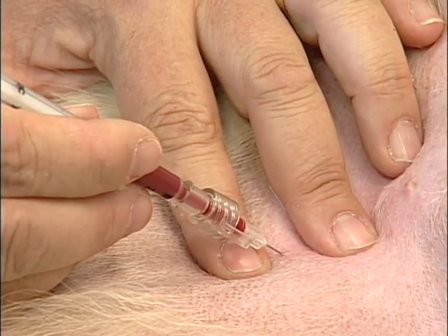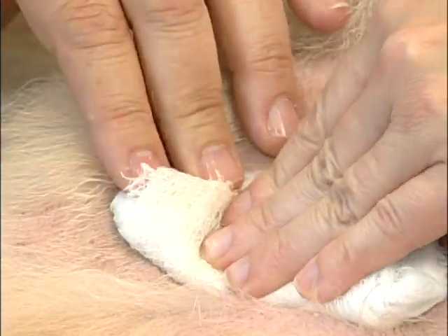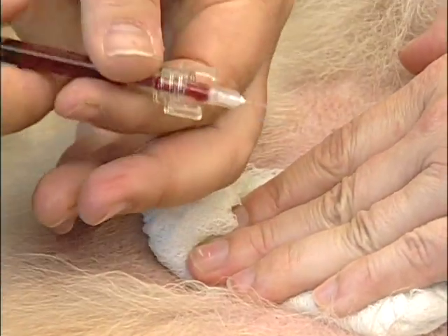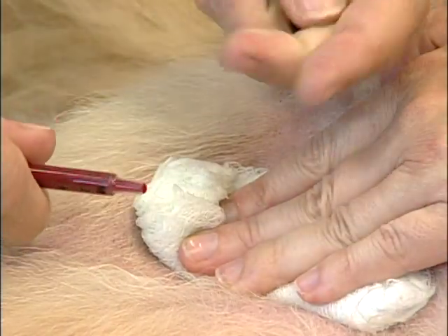As soon as it's filled to the preset level, I'm going to remove the syringe, we're going to hold that off with some firm pressure, and now I'm going to cap my syringe to keep any air from entering in that sample.